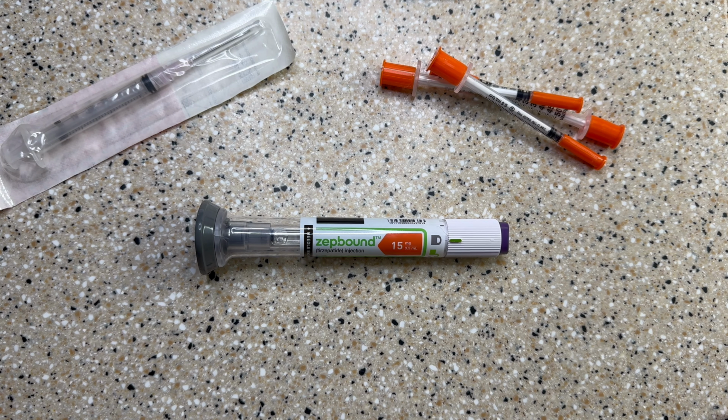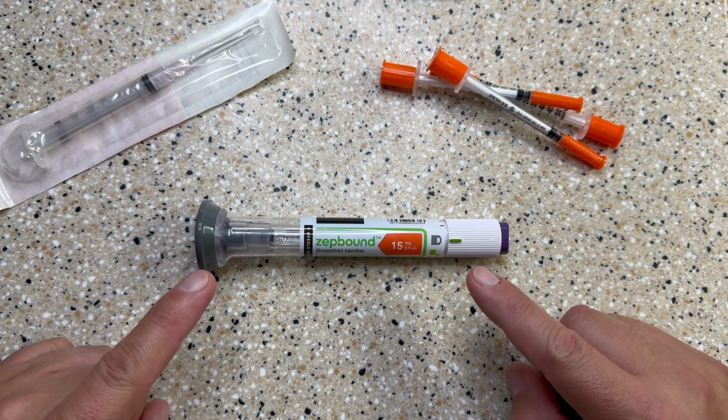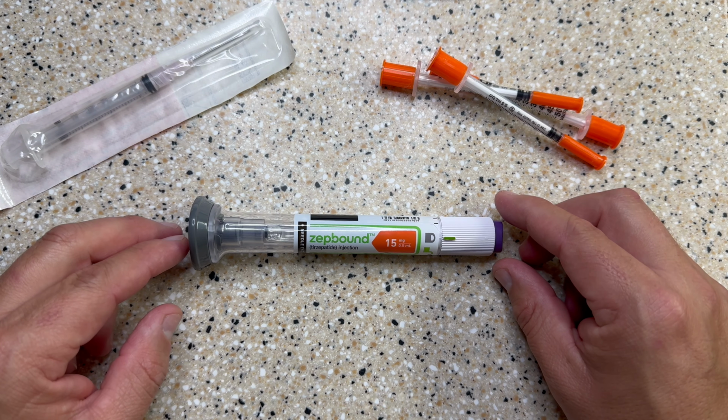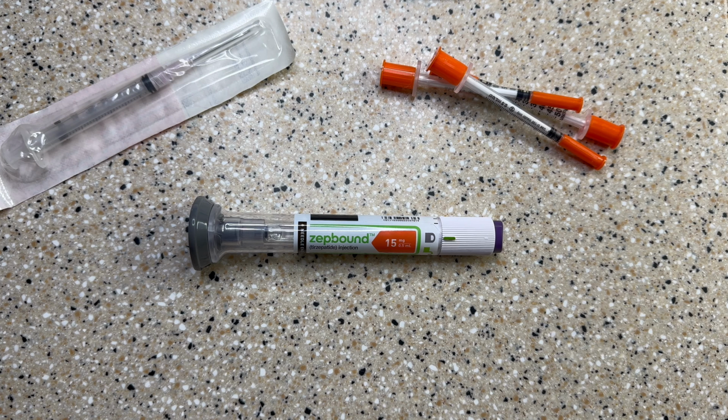Today I'm going to show you how to disassemble one of these fancy auto injectors. As you can see here, this is a Zepbound auto injector. There are several other companies that use these. I'm going to show you how to disassemble them safely.